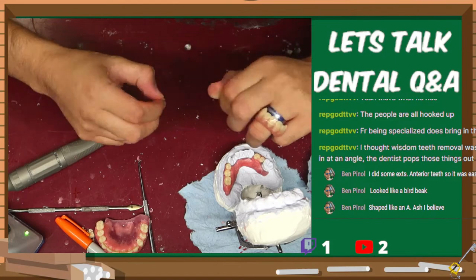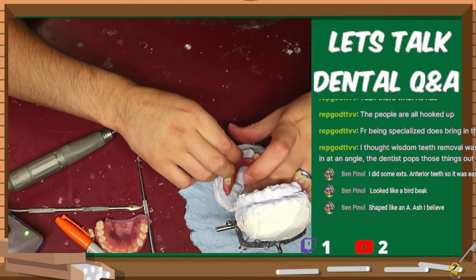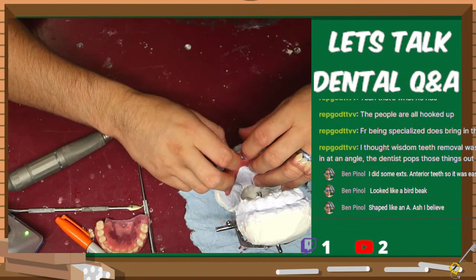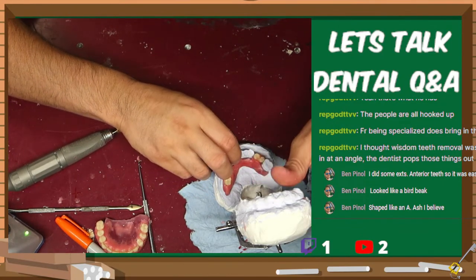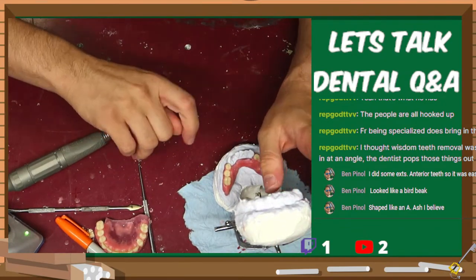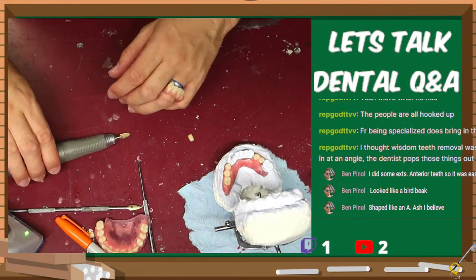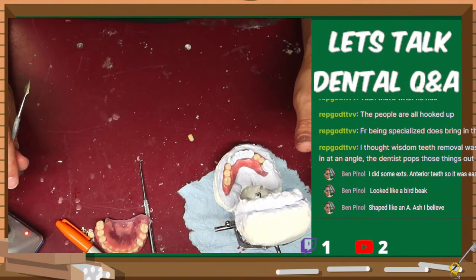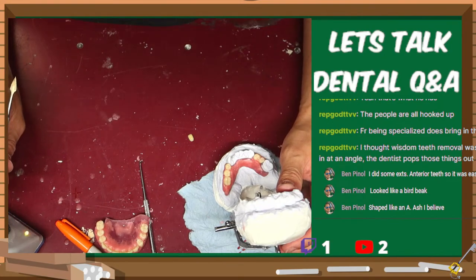Yeah, extractions are nice. Pretty easy, patient's numb, and they're not trying to flail all over the place. They're pretty easy to deal with. I think that's what I'm gonna want to do with this one. Let me go and get my wax set up, hopefully, but I'm just gonna go and do it like this instead.